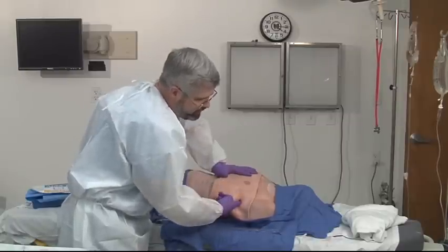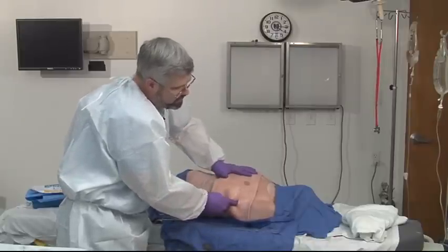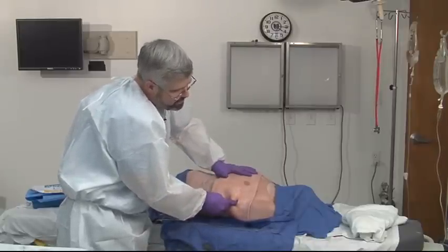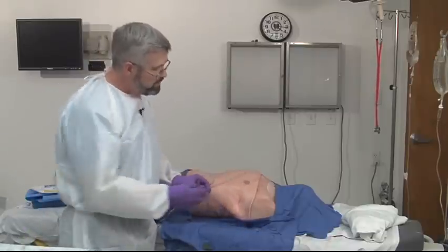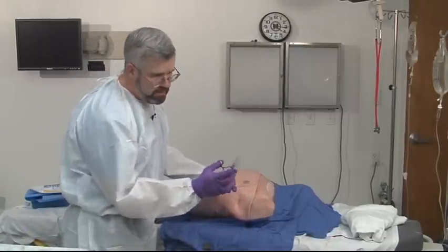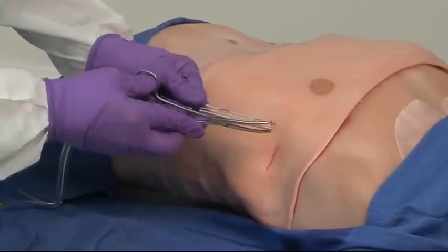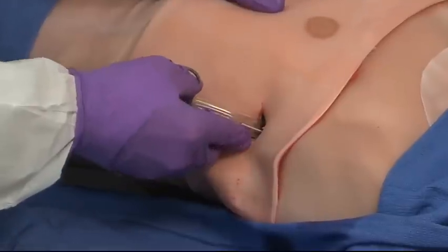So now we've confirmed we're in the chest. We can feel the lung under our finger. And now the next step is to actually insert the chest tube. There's a couple of different ways of doing that. You can actually try to put the tube in directly, but I think many people find it convenient to take your clamp, put it on the end of the chest tube, and then try to follow this track right back into the chest the same way you went before.